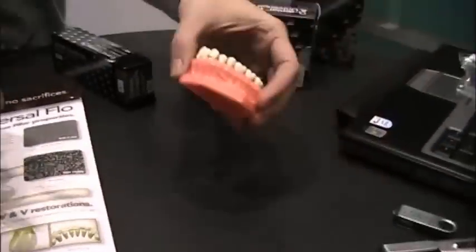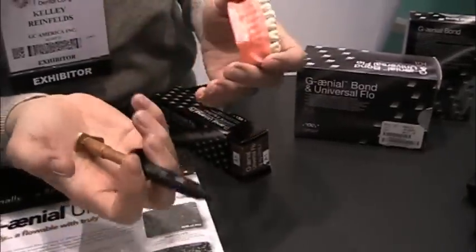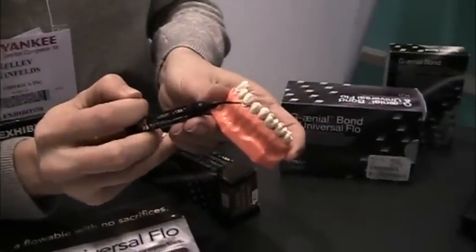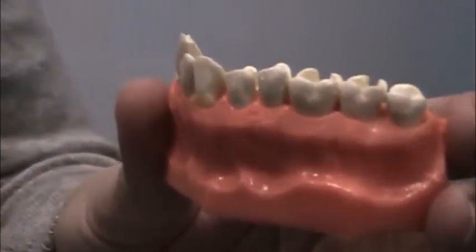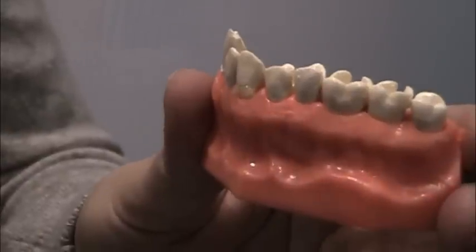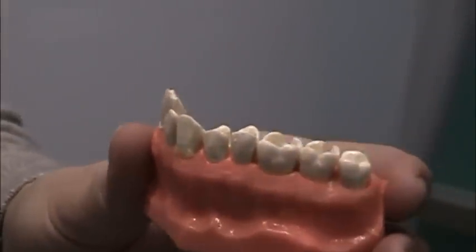I'll demo here on the typodont. This is the syringe it comes in — it's been redesigned and fits very nicely in the palm of your hand. It's very low flow, so you'll definitely need to work with the syringe to get it to come out. You can see there, filling a class five, and it's not going to run or slump — it stays right where you put it. You can actually create anatomy with it, and it is strong enough to use all the way to the occlusal surface in class ones and twos as well.